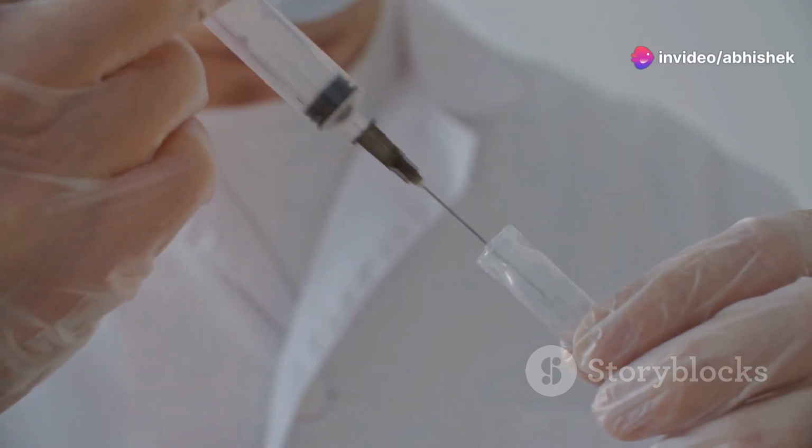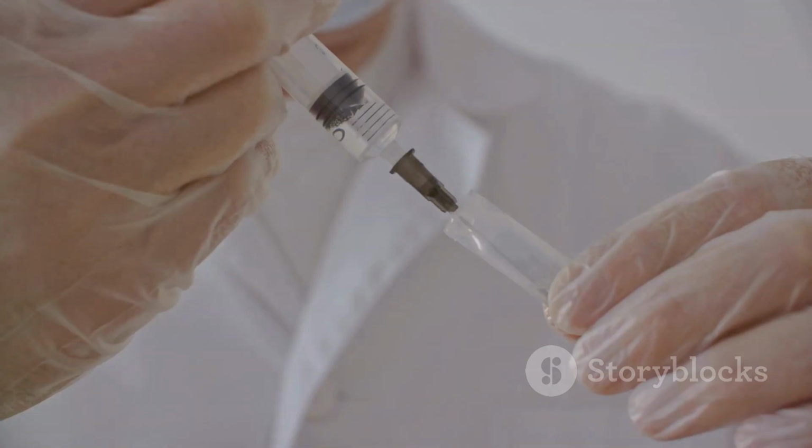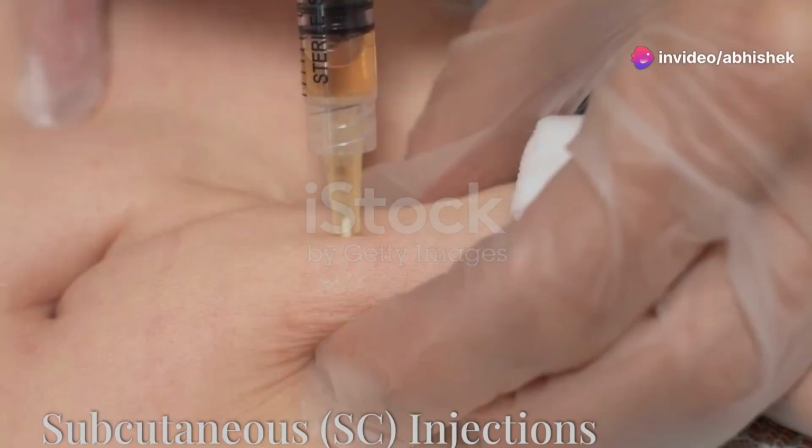IM injections are used for various purposes. These purposes include vaccinations, pain relief, and antibiotics. The dosage and type of medication determine the injection site.